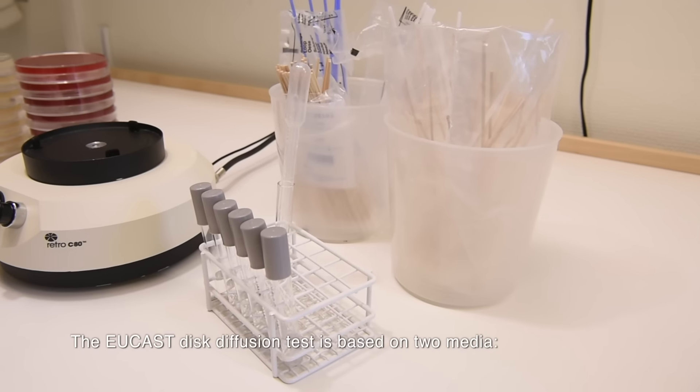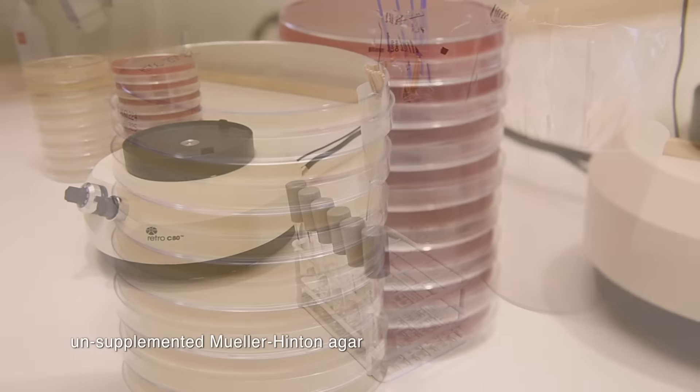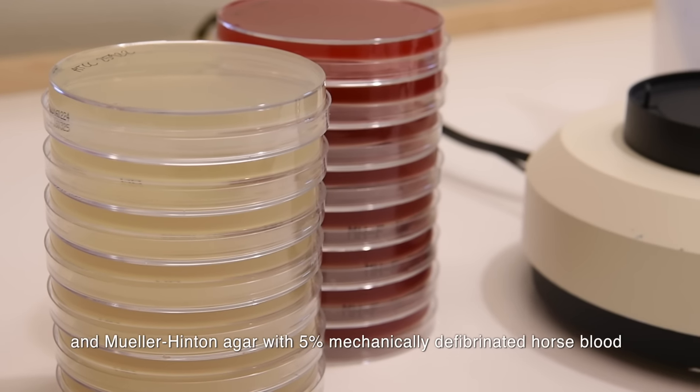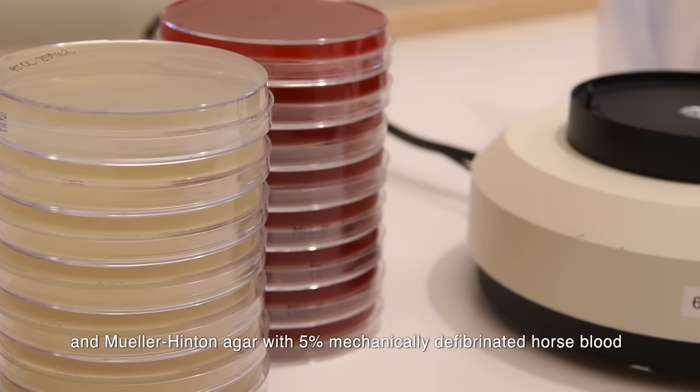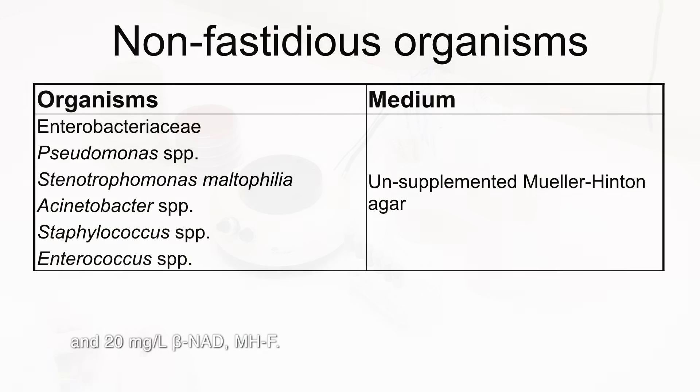The EUCAST disc diffusion test is based on two media: unsupplemented Mueller-Hinton agar and Mueller-Hinton agar with 5% mechanically defibrinated horse blood and 20 mg per liter of beta-NAD. This medium is called MHF.